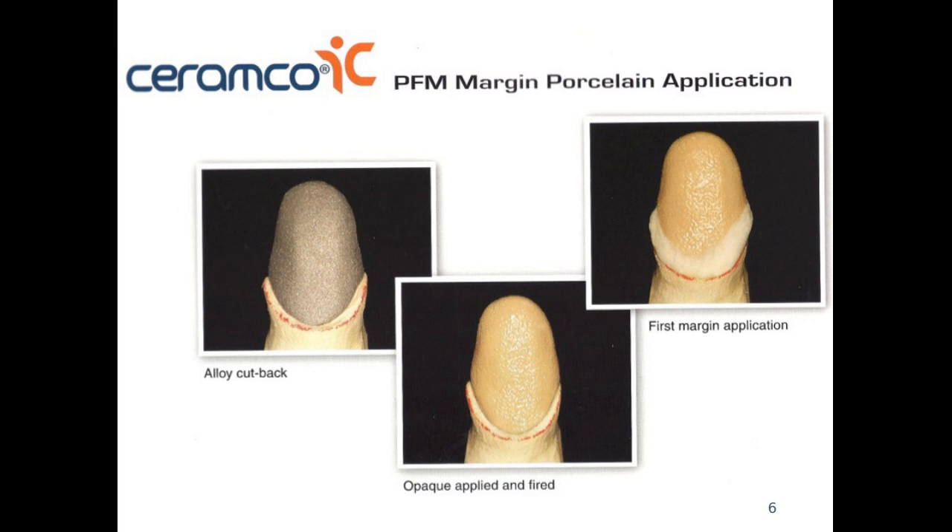For aesthetic purposes, especially for anterior cases with porcelain fused to metal crowns, we want to make sure the aesthetics are high. In those cases it is indicated to cut back the coping and build up the margin in porcelain, which gives a more natural aesthetic look towards the final restoration. When we apply the opaque first — either one coat or two coats — we fire it, and now every part of the coping surface is covered by the opaque and the metal doesn't show.